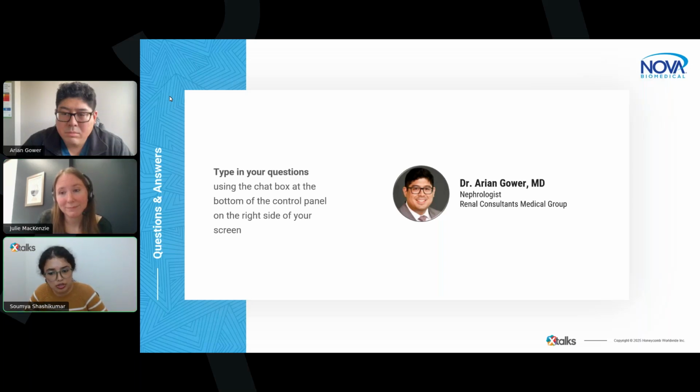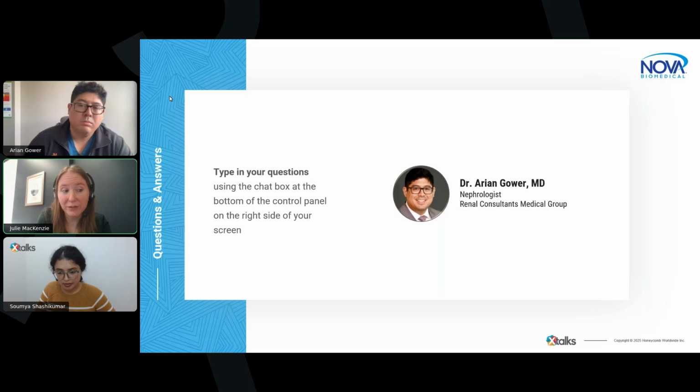Perfect. Thank you so much for that, Julie. Now we have another audience question for you. And this audience member wants to know, what sample volume is needed for your osmometers? Sure. So it does vary a bit. Anywhere from 20 microliters to 190 microliters would be the smallest sample volume size.